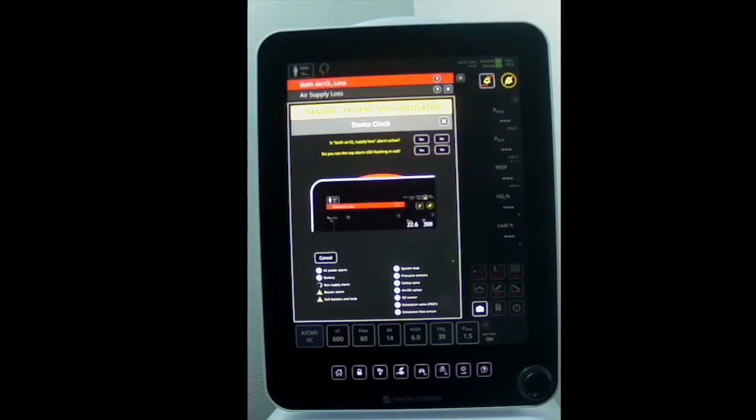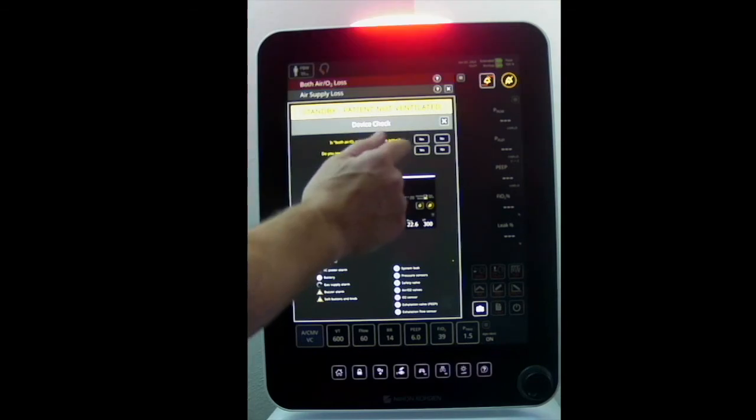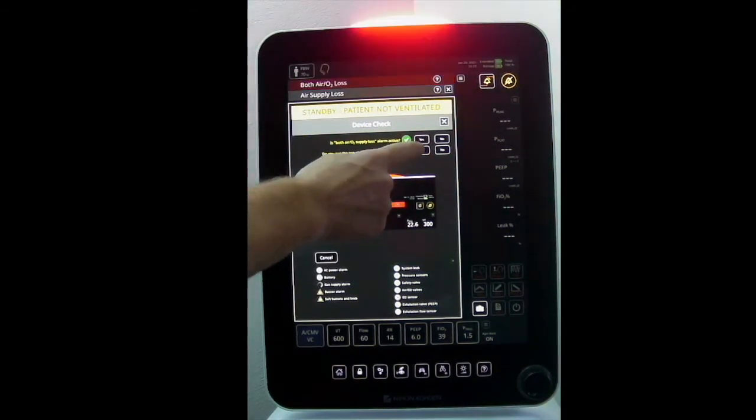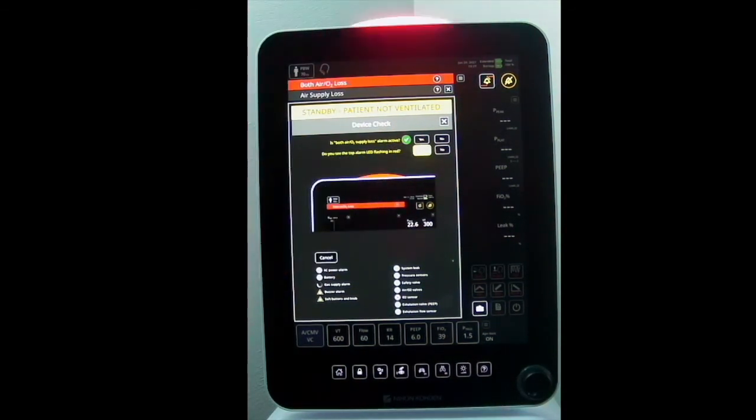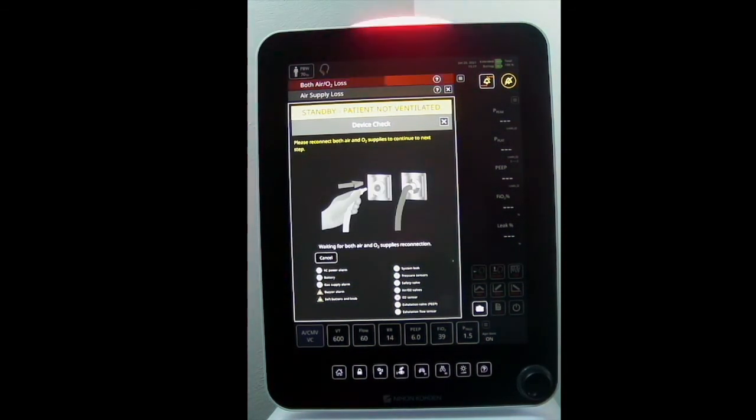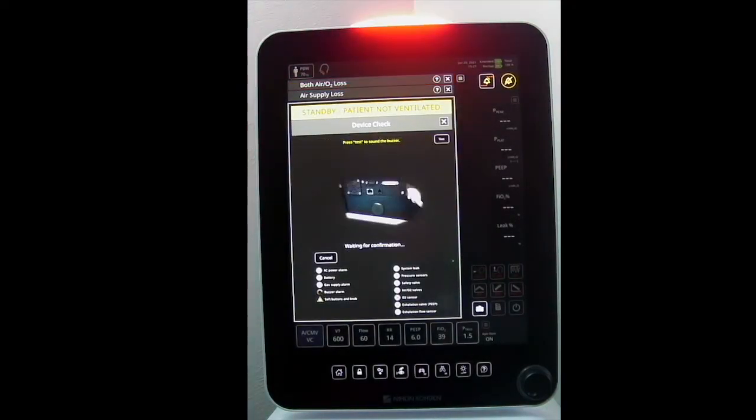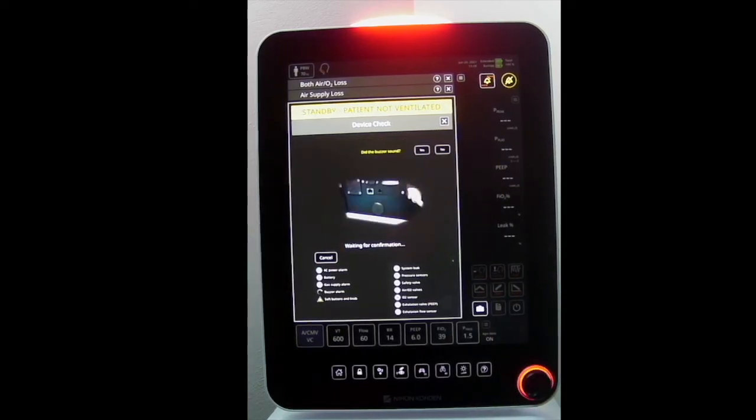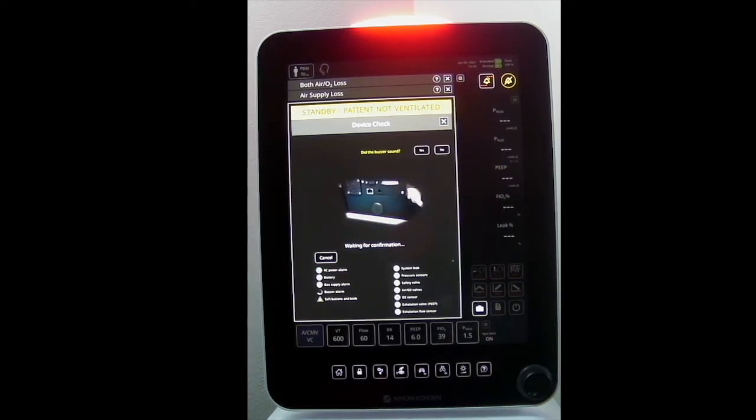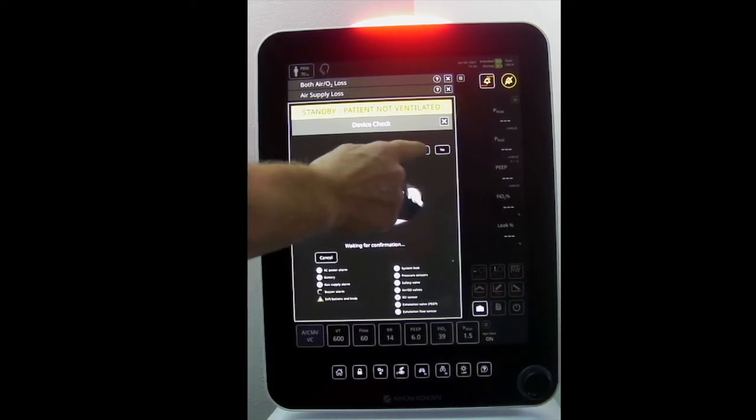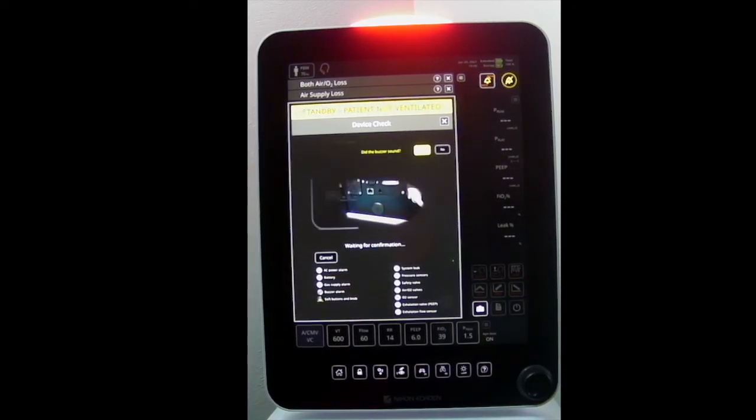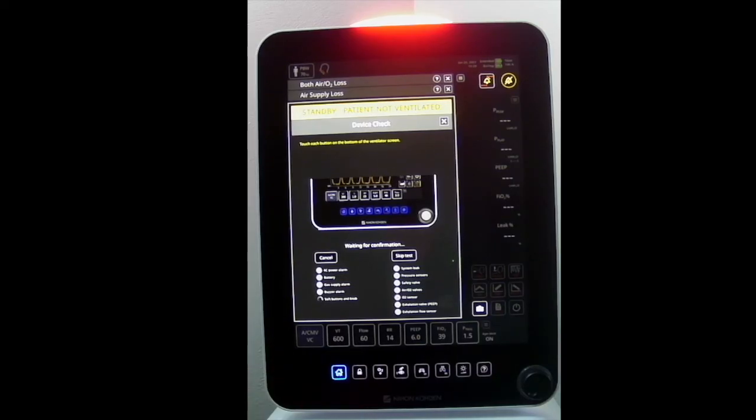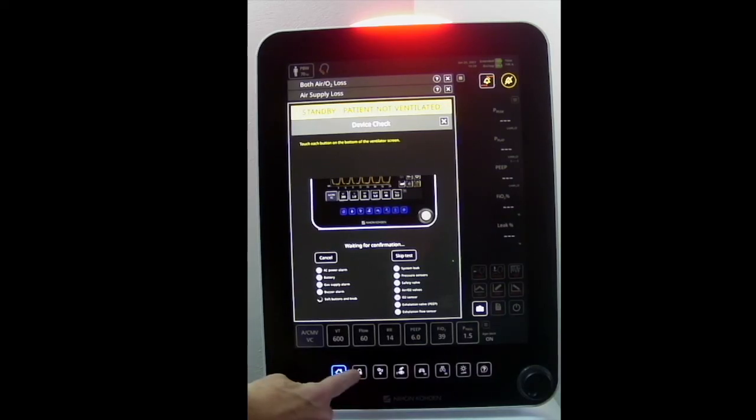Additionally, you will test the buzzer alarm, soft buttons, and encoder knob. It is important to confirm the buzzer alarm is functional, as this buzzer generates the audible alarm for both power down of the ventilator and device alert conditions.